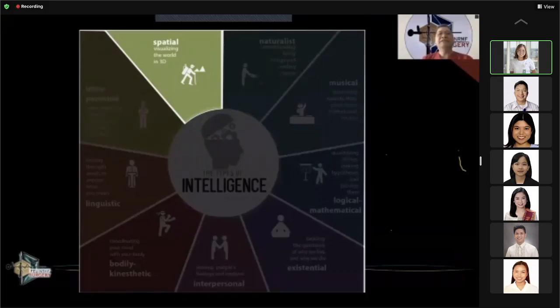This is actually the greatest skill, because you are operating through a video camera system. You have to understand the depth of the field. So it is very important, because if you miss something, if you miscalculate the structure, especially if it's a vessel, then it will be a disaster.